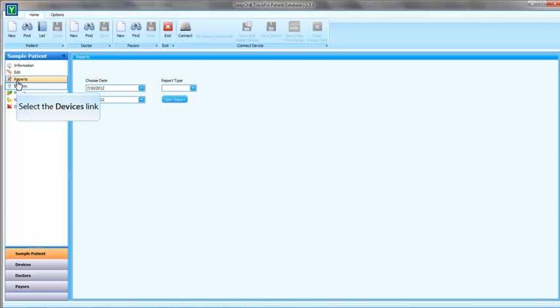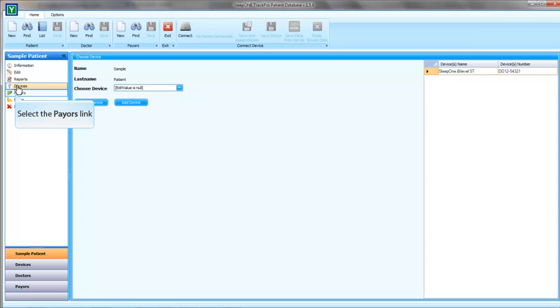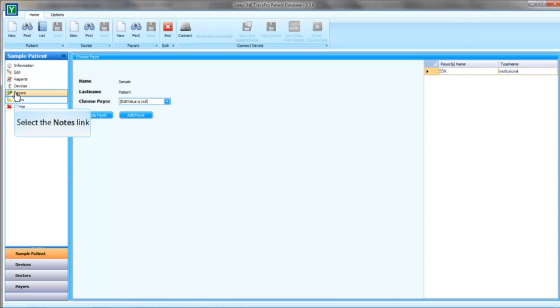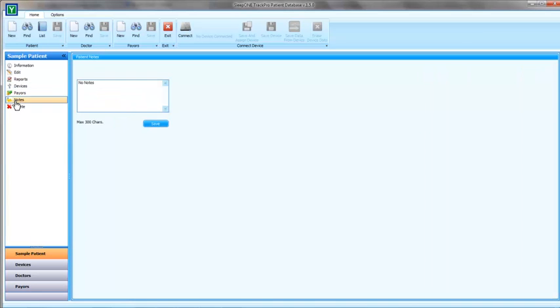In the Reports tab, you can get the patient reports if there is data available on the database. In the Devices tab, you can assign the device to the patient or you can deassign it. If there is a pair for the patient, you can select it from this field. You can also enter notes for the patient for future reference.